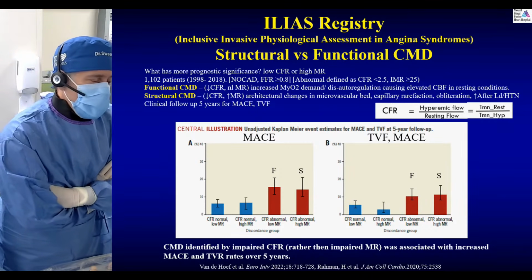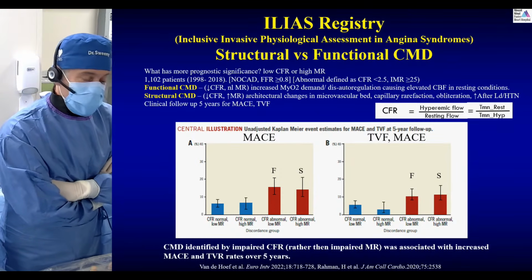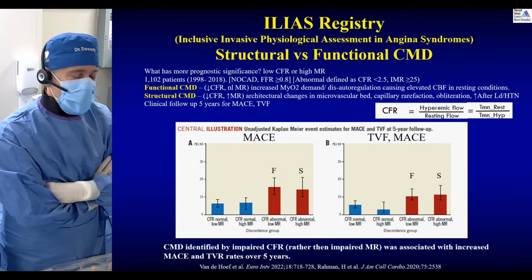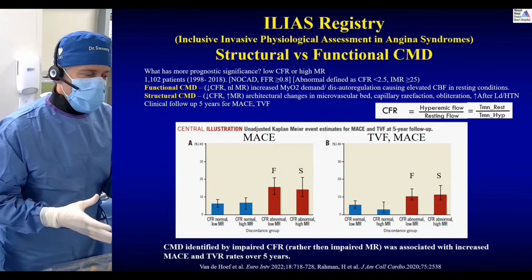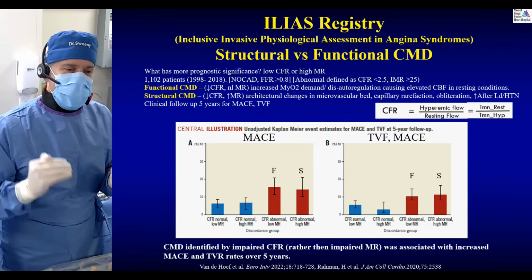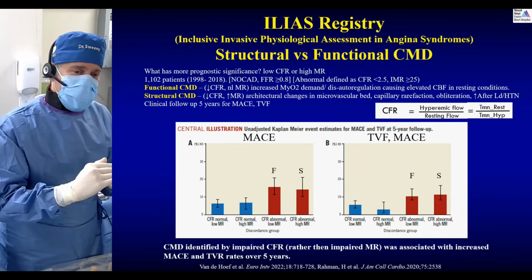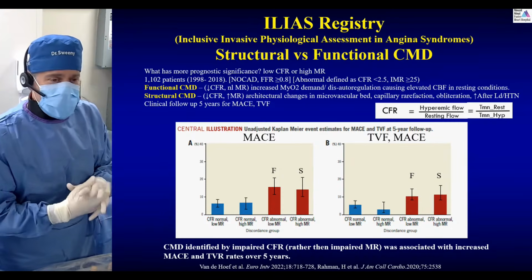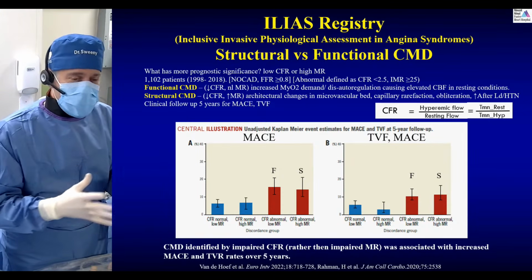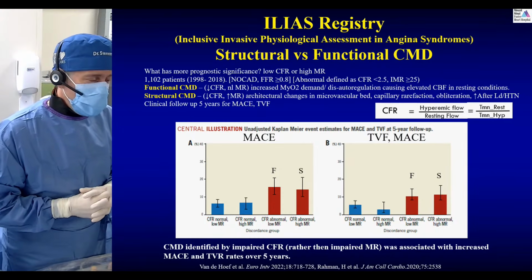And this can be from a state of increased, heightened myocardial demand, dysautoregulation that causes a resting elevated coronary blood flow. And remember your CFR, if your resting blood flow is high, the transit time is going to be low, and that lowers your CFR, and your CFR is going to be coming out as abnormal, but it's because you have a high resting coronary blood flow.